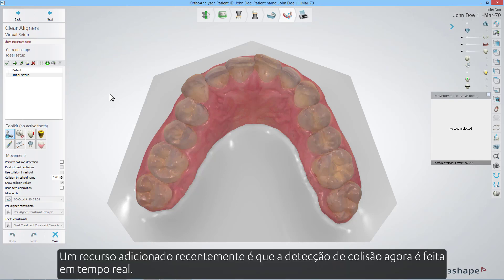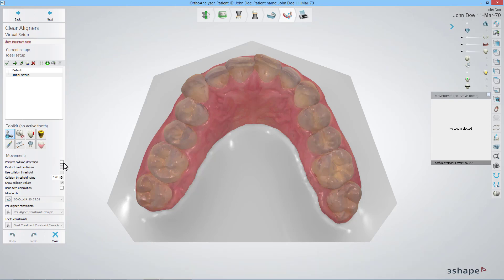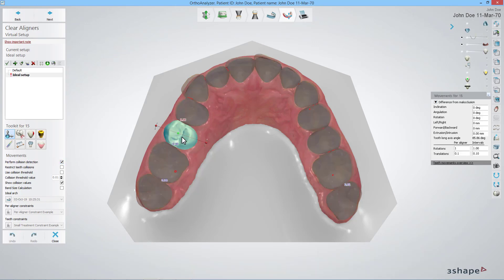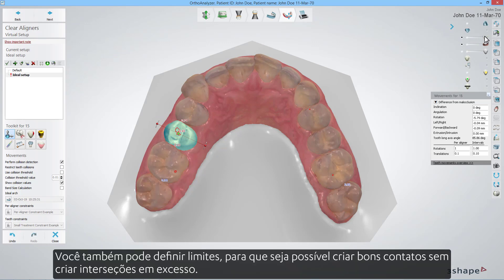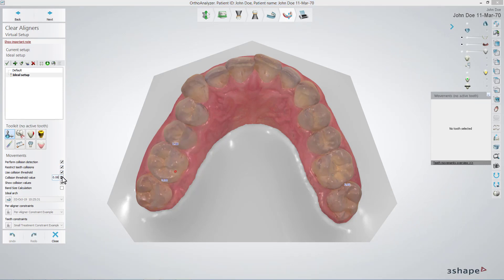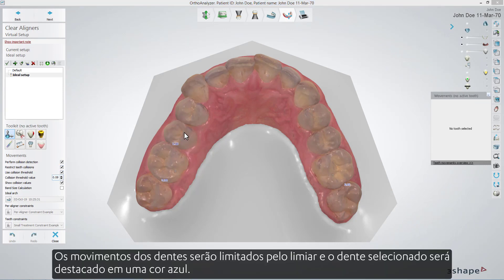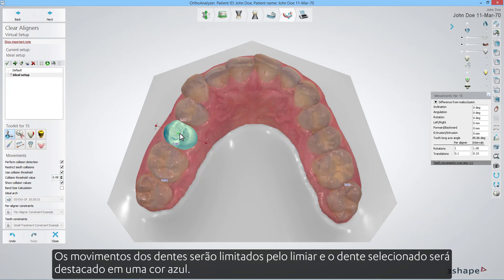A recently added feature is that the collision detection is now done in real-time. You are also able to set thresholds, so it is possible to construct good hard contacts without creating excessive intersections. Teeth movements will be limited by the threshold, and the selected tooth will be highlighted with a blue color.